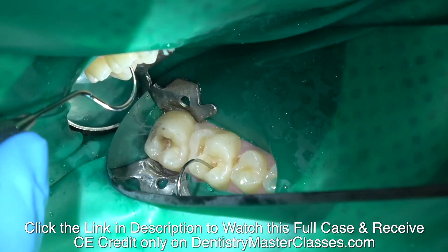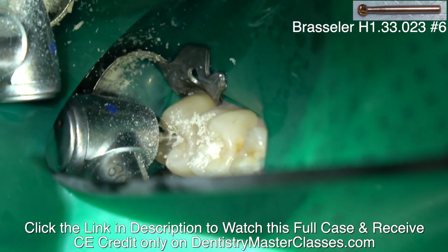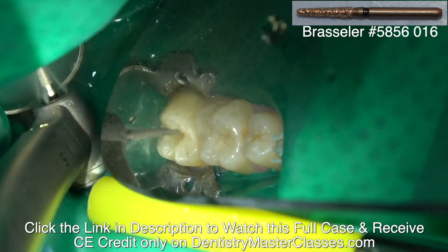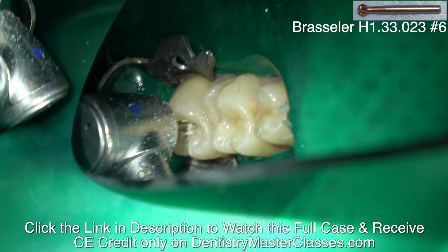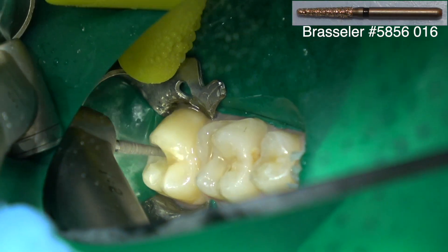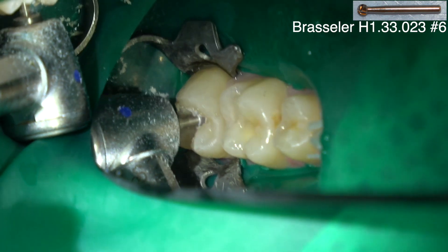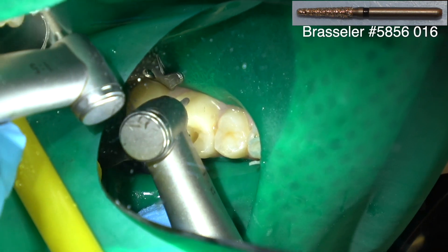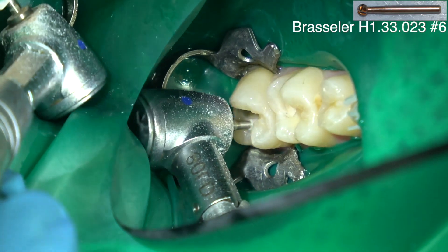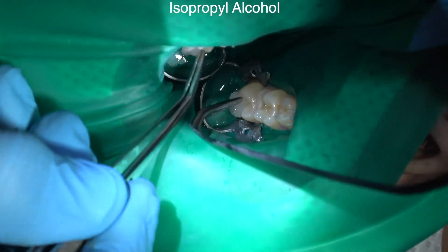How do you know when you've gotten rid of all the decay? What if it's just stained? You take your explorer and when it's not sticky — when it's hard like a tabletop — then as Dr. Harvey, one of my instructors in dental school, used to say, it's affected but not infected. Once it's hard, I'll take one more pass with my slow speed handpiece round burr and remove anything that comes off easily. If you've got soft enamel or dark dentin it can be hard to differentiate. Use your explorer, and that's why I put an isopropyl alcohol cotton ball in the tooth once I feel like I've gotten every bit of the decay — just as a final step to address that bacteria. I'll let it soak for a couple of minutes.